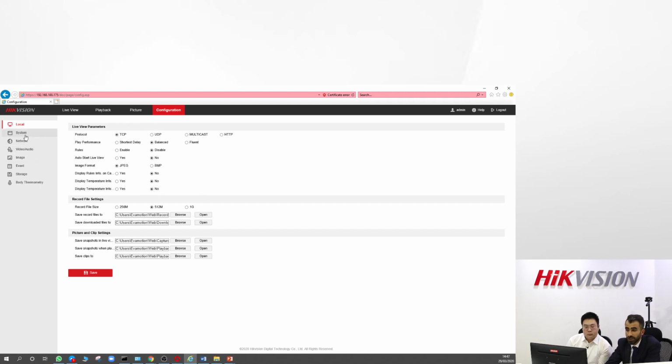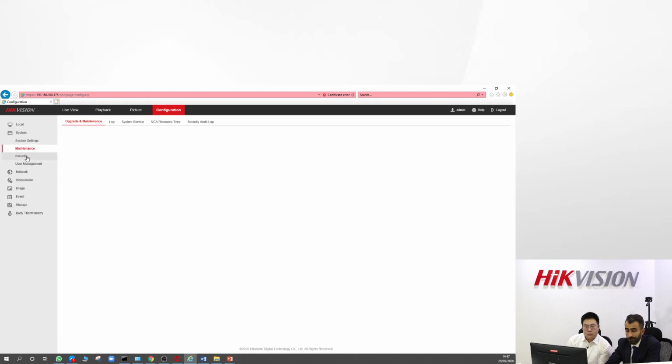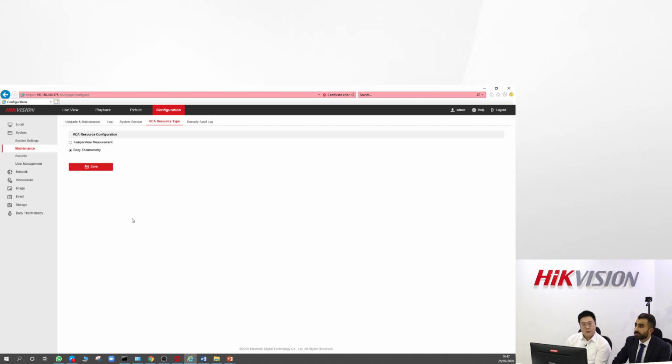You don't need to change anything. Here also for the VCA resource type, you can check the body thermometer only.